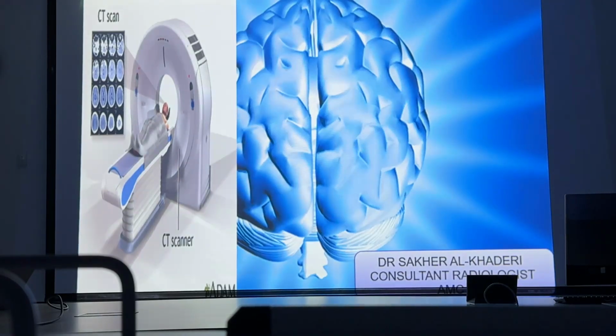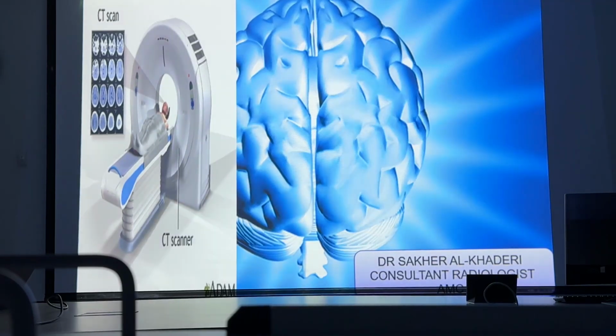Good evening, my audience. Today we'll speak about an important subject in CNS for the radiologists and radiographers and physicians, which is brain CT scan and basic interpretation. Let's say part 1.